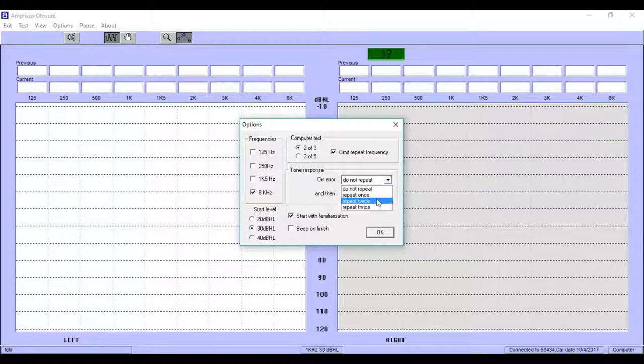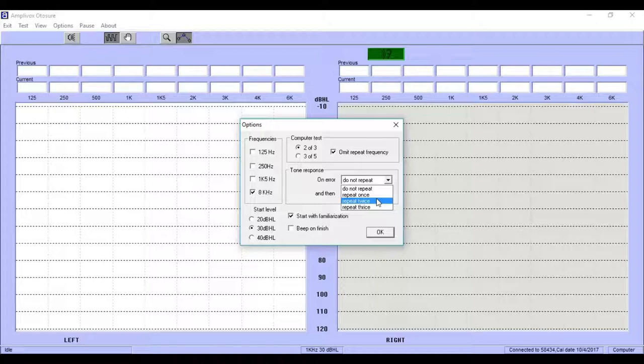In case of an error, the options are given to not repeat the test tone, repeat once, twice, or thrice. This setting is based on your experience and personal preference on how often the tone shall be presented when an error in the patient response is found.